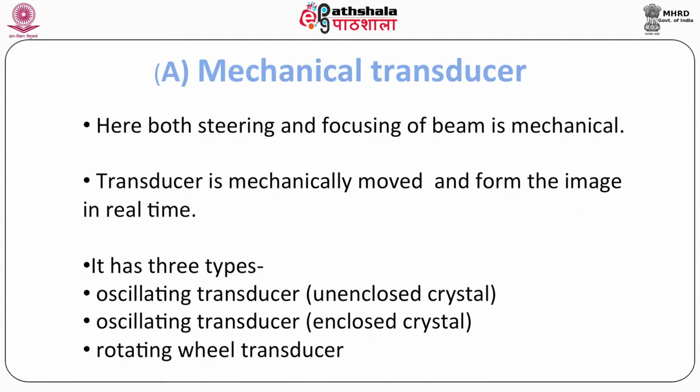Now coming to the mechanical transducer. In mechanical transducers, both steering and focusing of the beam are mechanical, as you can see here.